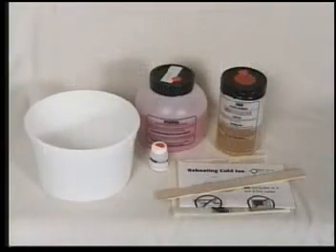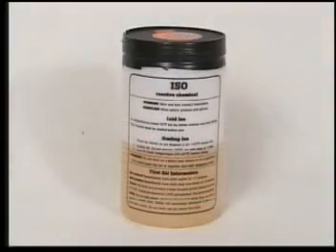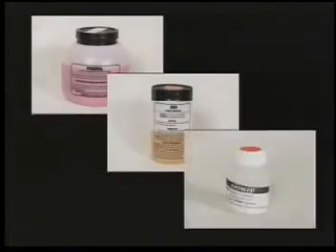The foam-in-place seating system uses 3 liquid ingredients, which are collectively known as liquid SunMate. Each chemical is pre-measured and packaged in a separate container. The 3 chemicals, polyol, iso, and catalyst, are collectively called a unit.